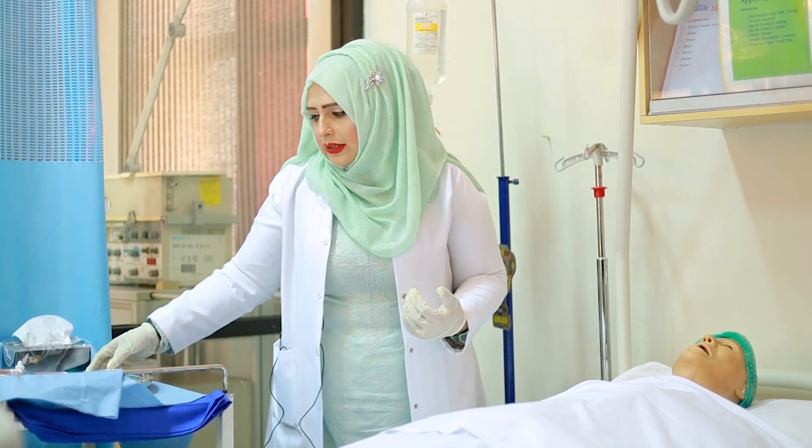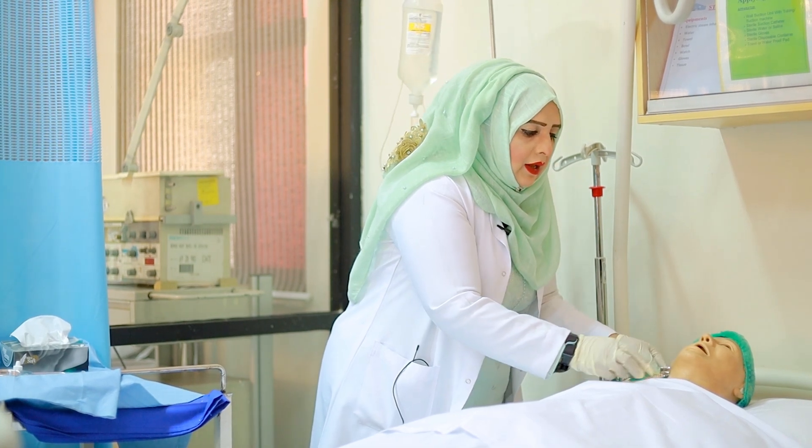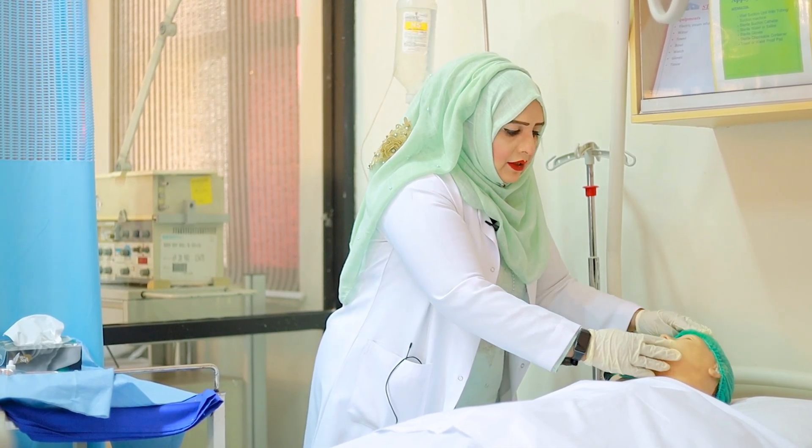We will start the procedure and keep the receiver at the side of the patient, on the side where we are going to do the eye irrigation. Before starting the eye irrigation, you must keep in mind the flow of your normal saline — it should not be very strong, and the patient must look upward, because the flow can disturb the cornea as well. So we have to protect the cornea. We will request Mr. Ali to please look upward and give the instruction first. When the patient looks upward, we will start our irrigation.